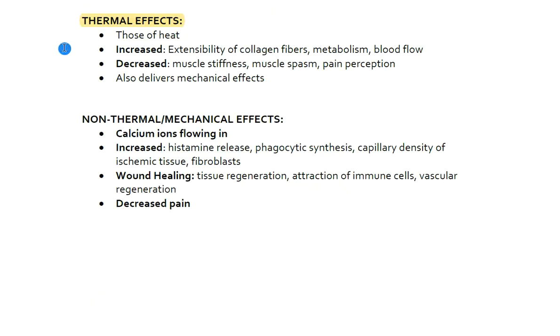So as we look at the two main effects of ultrasound, you have your thermal effects, which is basically that of heat. Think about this like a hot pack, but we know that ultrasound can penetrate deeper, whereas a hot pack may go up to around 1 to 2 centimeters, 10 to 20 millimeters. Ultrasound is capable of going into the tissue at depths up to 5 centimeters. But of course, this is going to vary on the waveform in the frequency. So we're going to talk about this later, but it can go up to 5 centimeters or 50 millimeters.